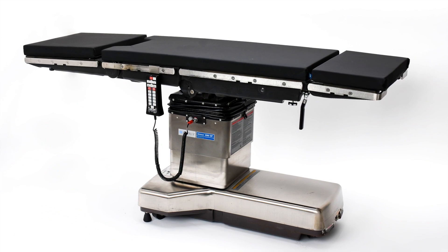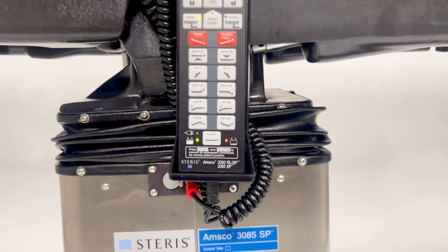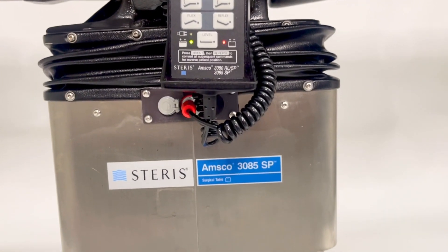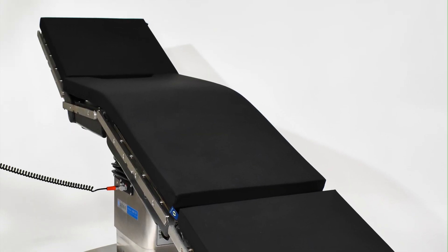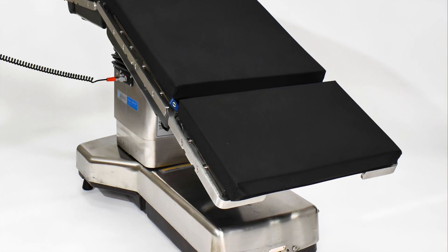Today we are highlighting the Steris AMSCO 3085 SP surgical table. The Steris 3085 SP is one of the most reliable, popular, and cost-effective surgical tables on the market.